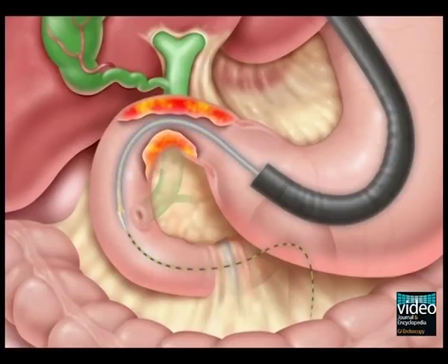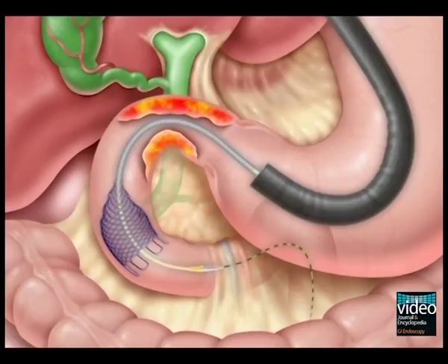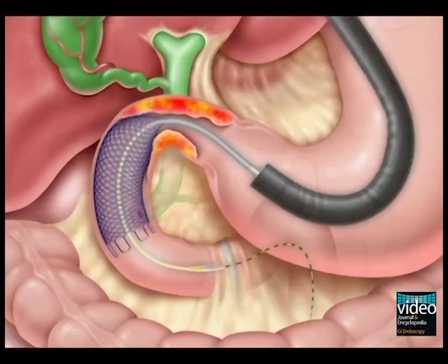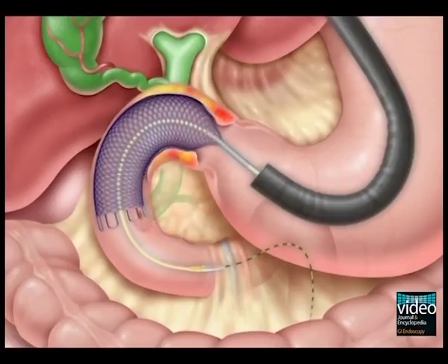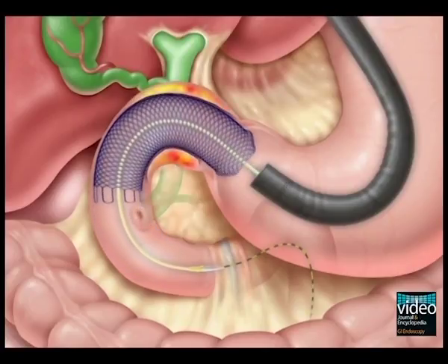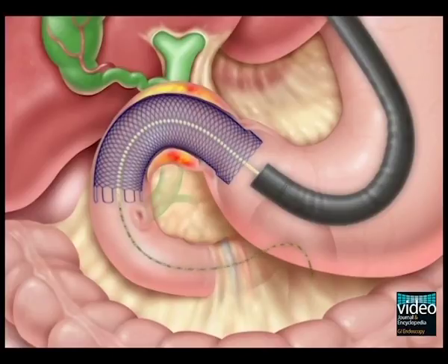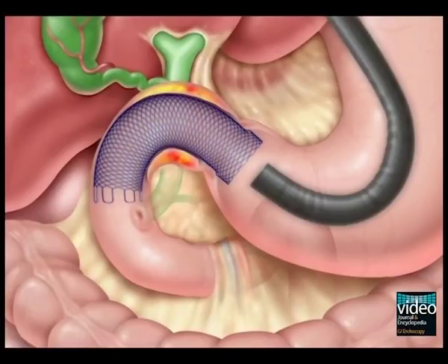The delivery system is advanced along the guide wire. Finally, the stent is deployed with adjustment of position. The guide wire, delivery system, and endoscope are then removed.